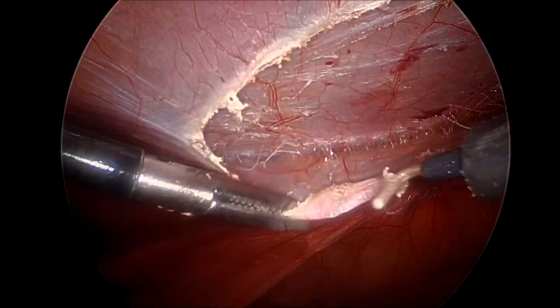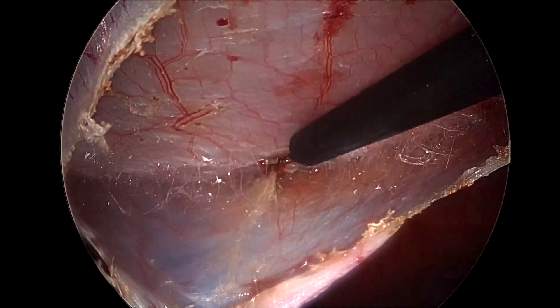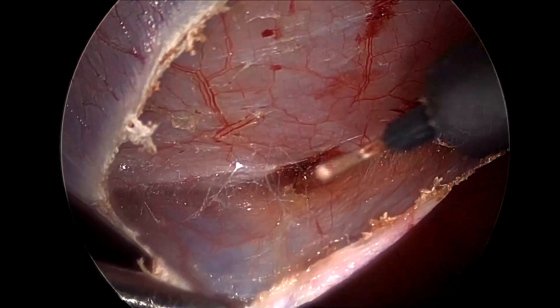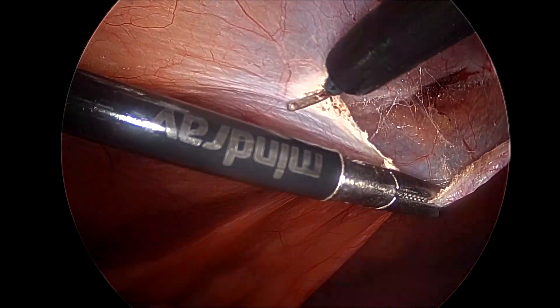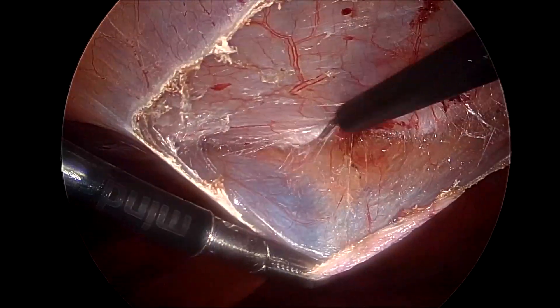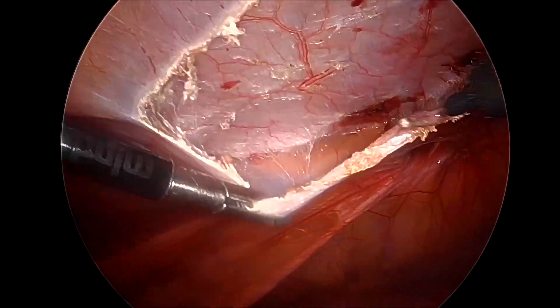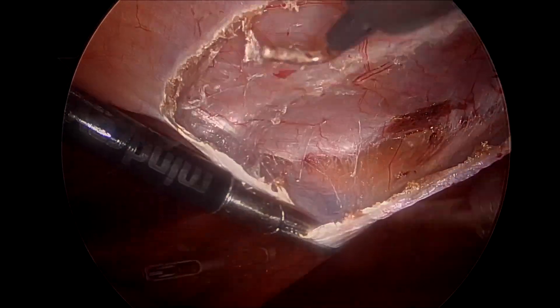In more difficult cases where you feel the peritoneum is super thin, a scissor can be used in place of a hook to do a better dissection. We try to keep the camera as close to the area of dissection as possible, so the camera person or assistant should be well trained and should understand the anatomy of the plane in which we are working.